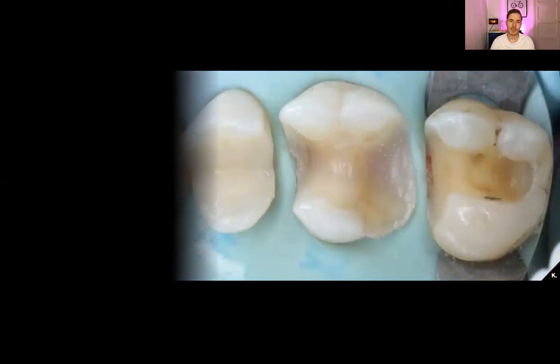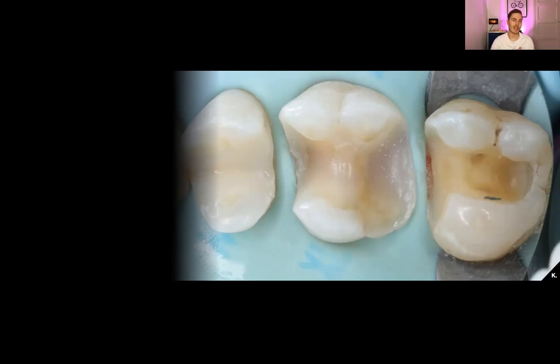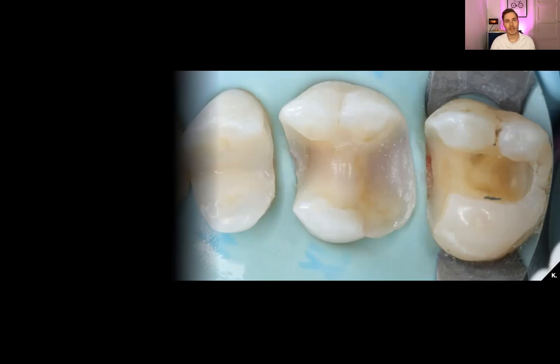Here you can see the situation after deep margin elevation. I used my AquaCare air abrasion device to abrade the surface, then I used OptiBond FL — etchant for 30 seconds on the enamel, 15 seconds on the dentin — and after rinsing thoroughly with water I used my OptiBond FL primer for 20 seconds and then my OptiBond FL bonding. After light curing, I placed a little bit of flowable Majesty ES2 by Kuraray just to raise the margin a little bit. After removal of the band you can still see a little bit of excess composite, but that's something I can easily remove when all the deep margin elevations are done.